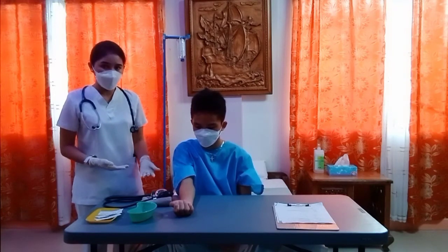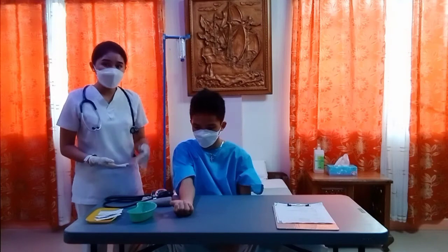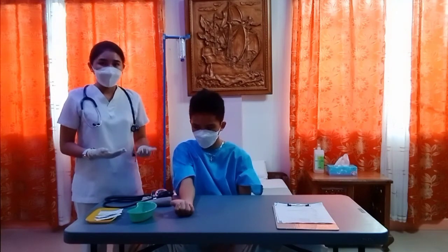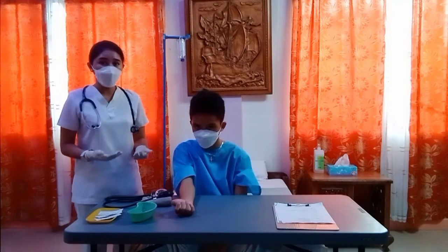The blood pressure increases when the forearm is below heart level. The blood pressure decreases when the forearm is above heart level. Next is to expose the upper arm.